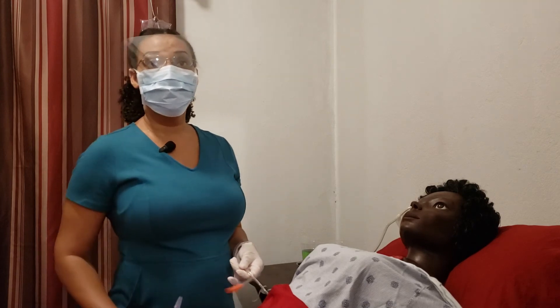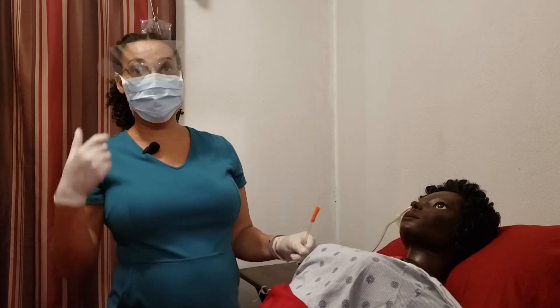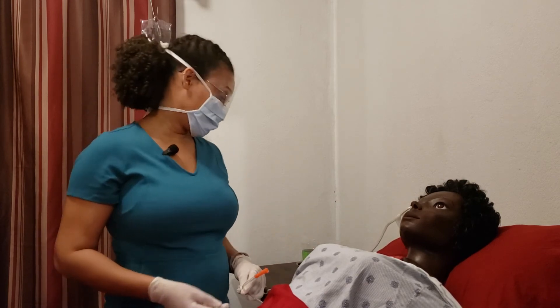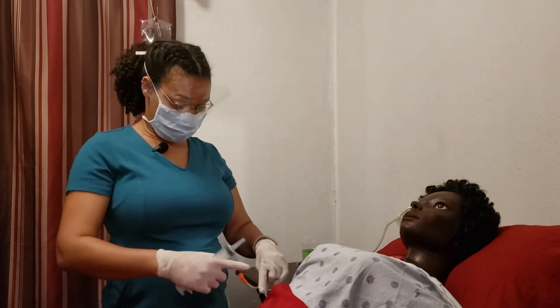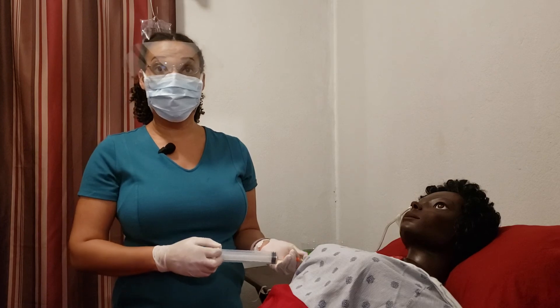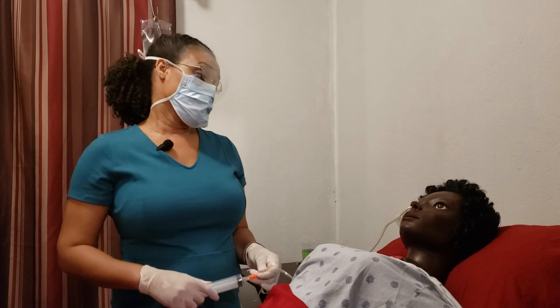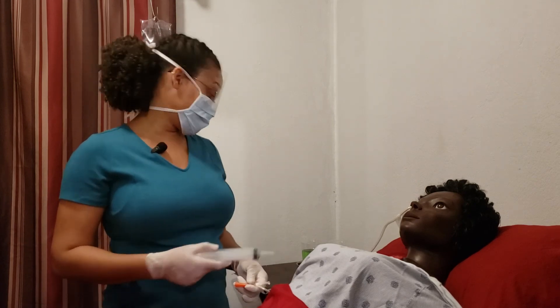If you're using the intermittent method, it's pretty much the same thing except you're using a syringe to pull back instead of allowing it to gravity feed. You're pulling back, allowing water to go in, and then repeating the pull-back. You go ahead and do it as many times as is indicated.